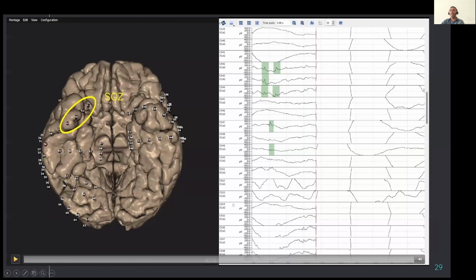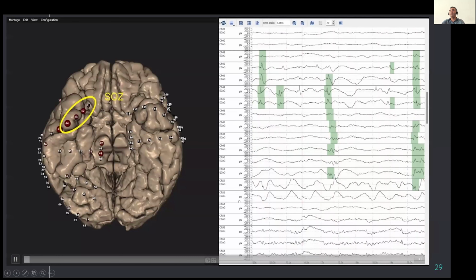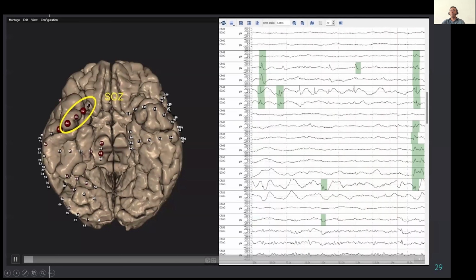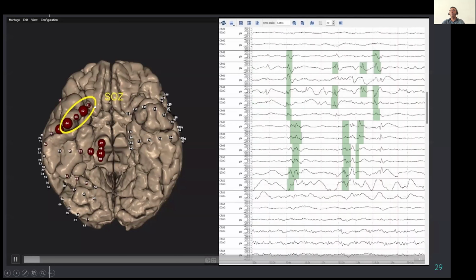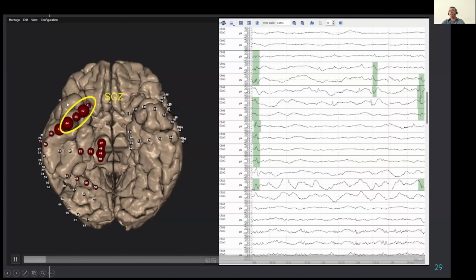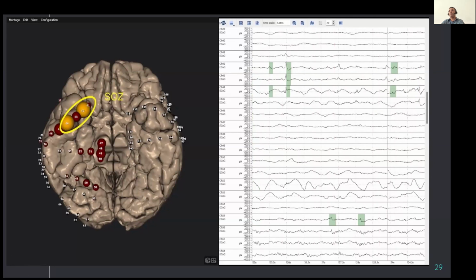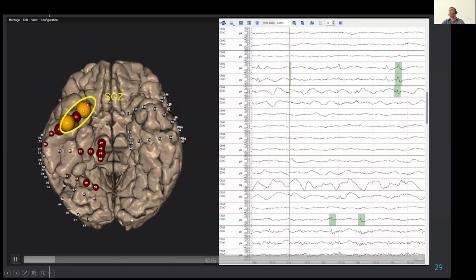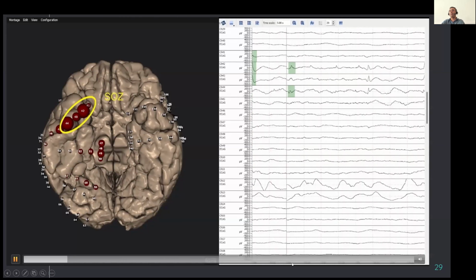So here we can see our detector that works online. After a while, the bubbles pop up and we see which area is important. Then when we move through time, it will change. Then we don't need to have, for example, half an hour or 1 hour of data to calculate, and that can be operated in real time.